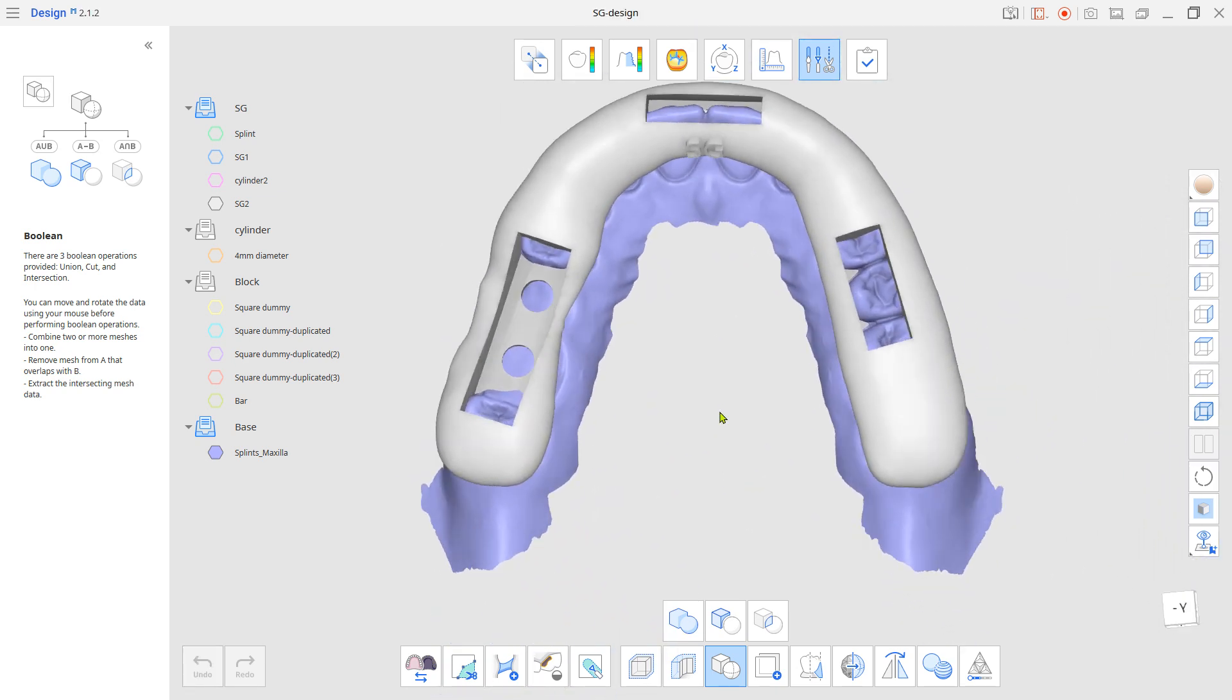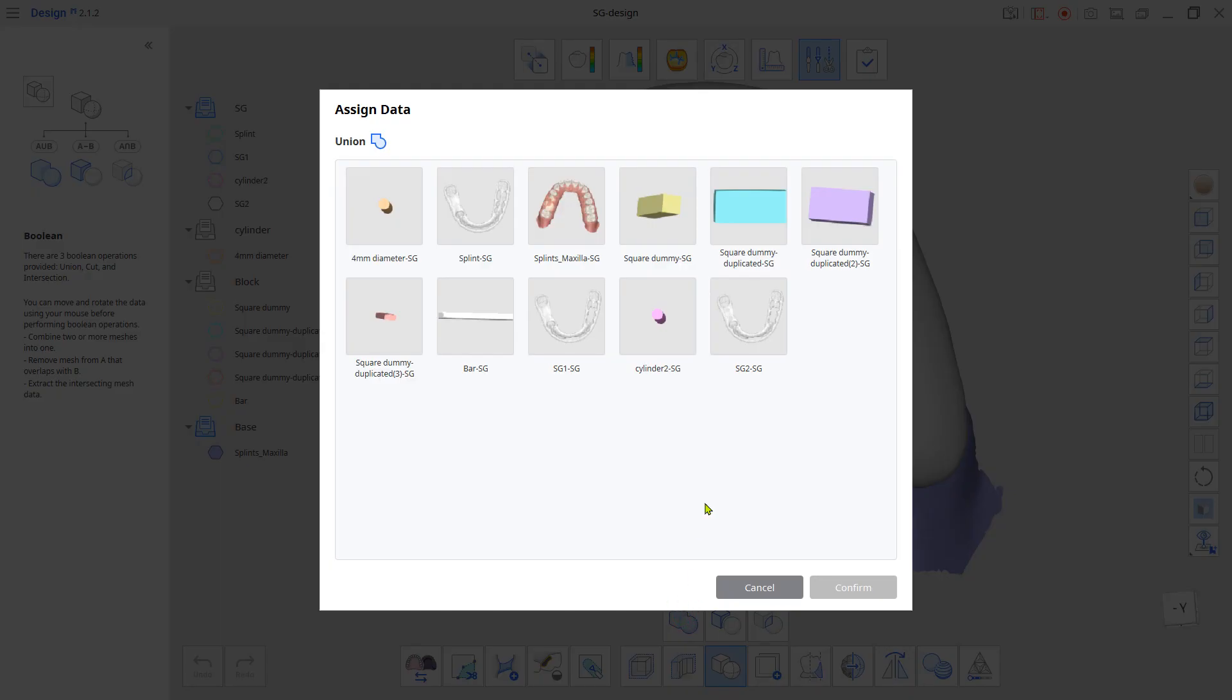For the last step, use the Boolean Union tool to bond the surgical guide and the bar together.